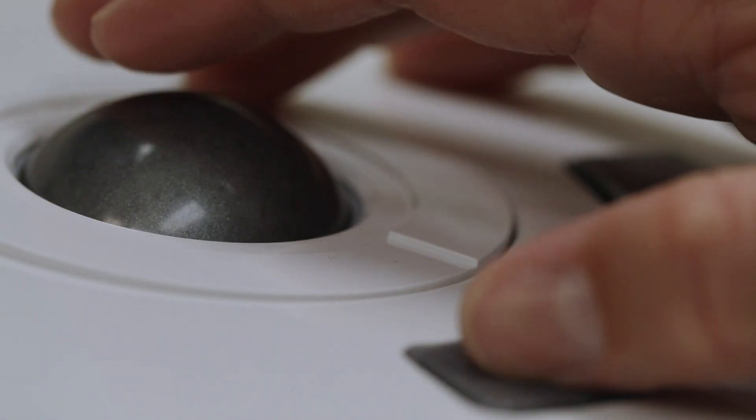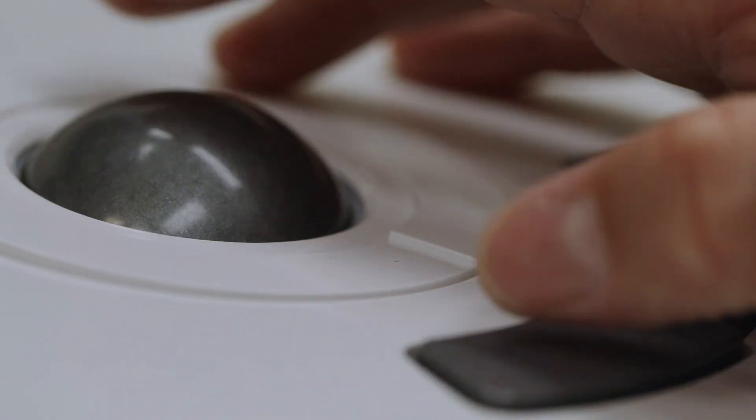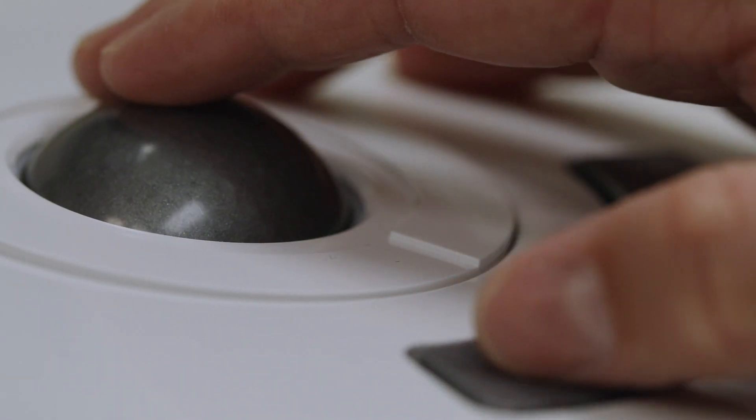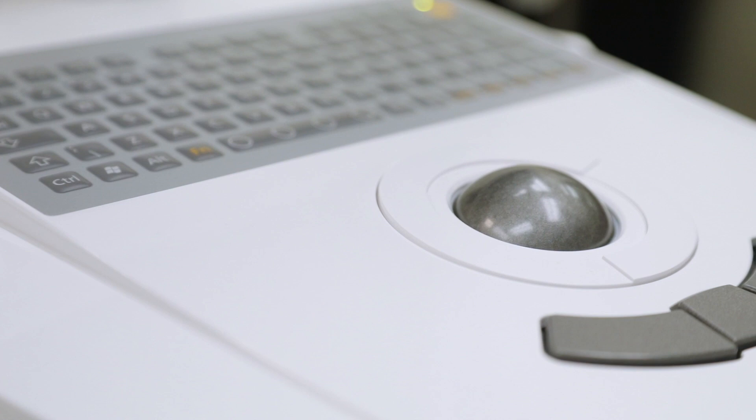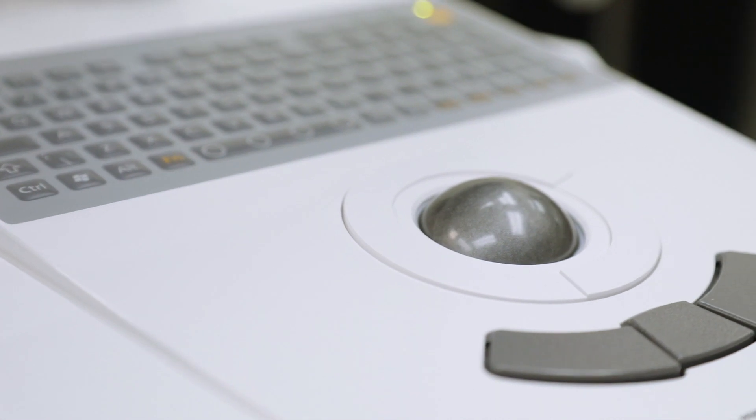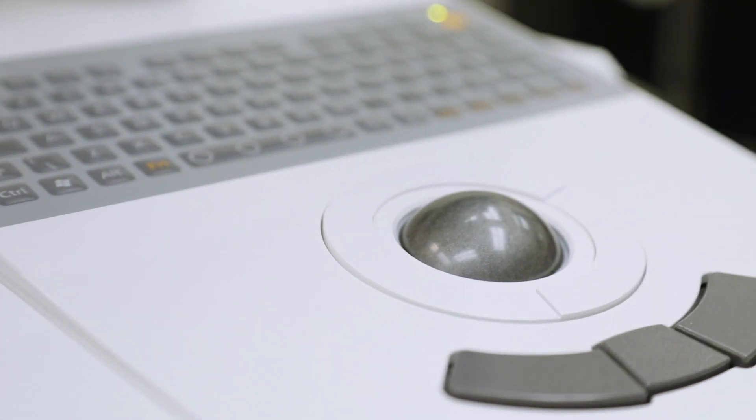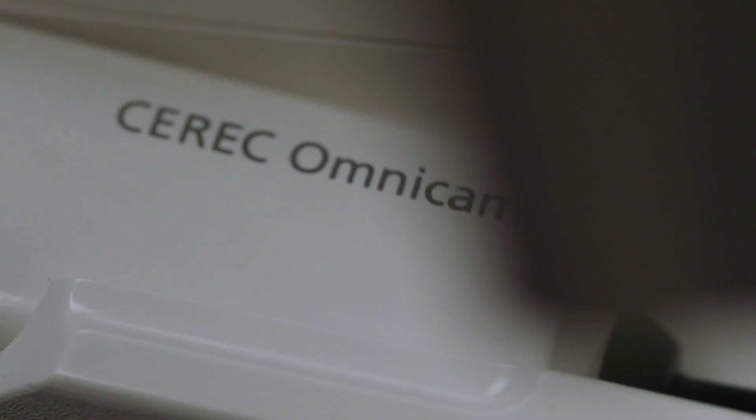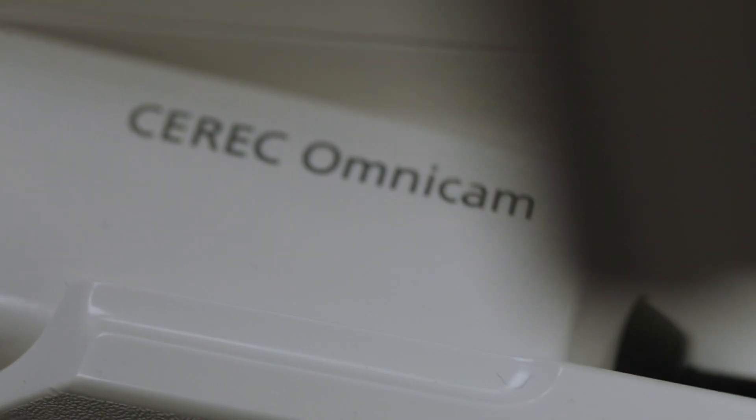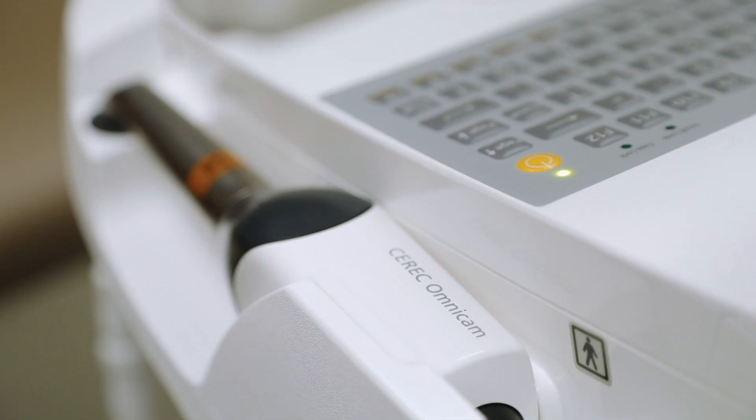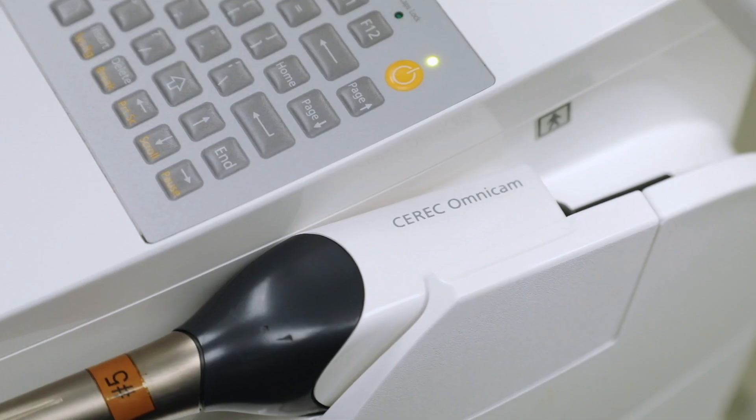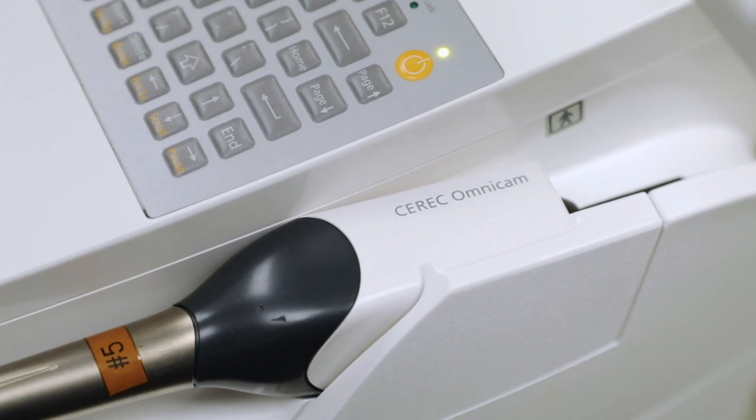The last thing I want to point out is the Omnicam camera. You can see that it is attached to the main unit or the base. There is a locking arm that keeps this camera in place when it is not being used.